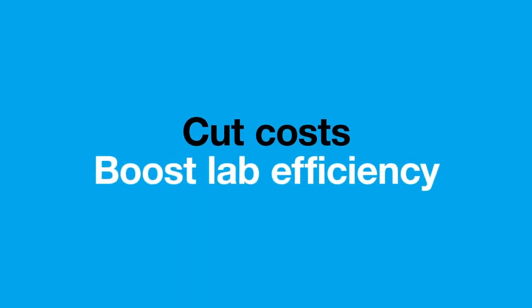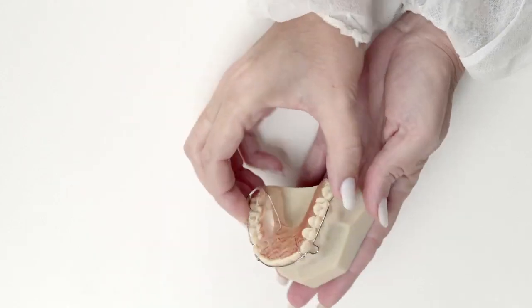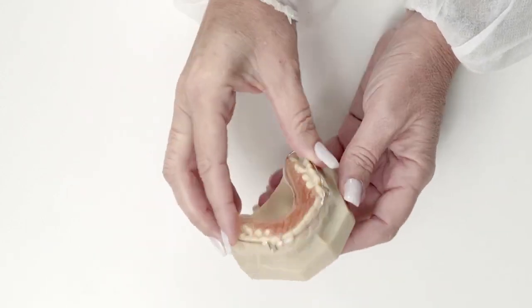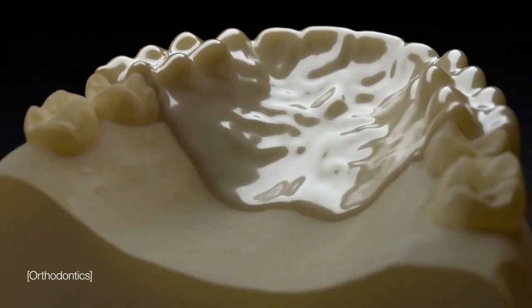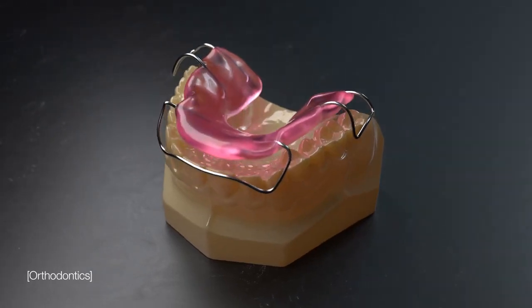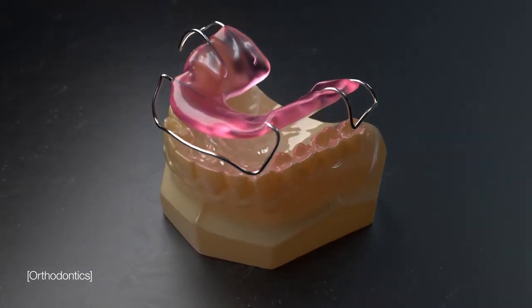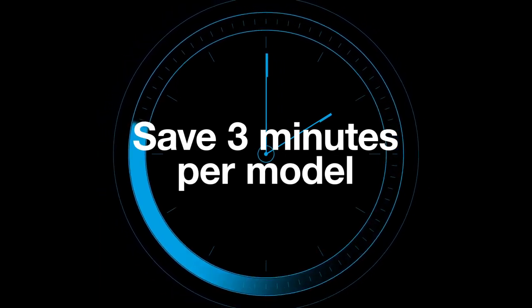Helping to cut costs and boost lab efficiency. Cut days off delivery times by producing more accurate, comfortable orthodontic devices. Our unique separator digital material coats models in print, minimizing post-processing time and making acrylic and wax removal easy, helping to save up to three minutes per model in manual labor.